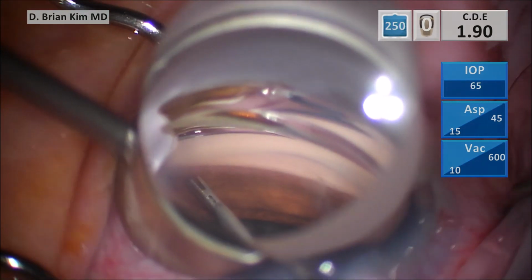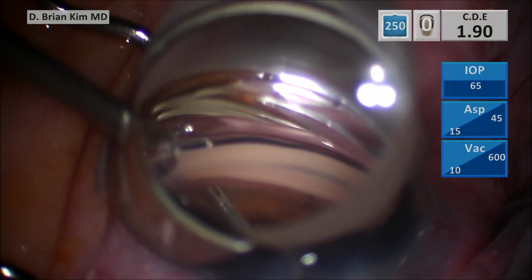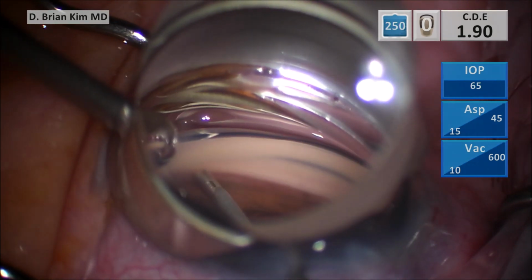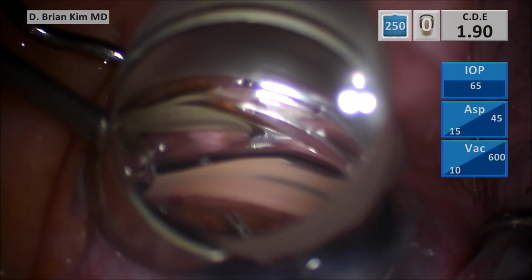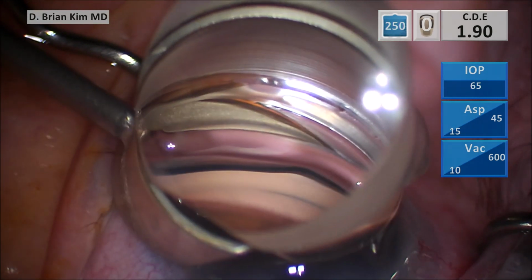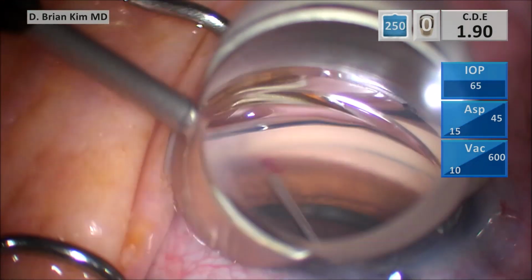I'm going to place the trocar into the TM, making sure I'm en face as well as not having the trocar being turned side to side or up and down, which can reduce the efficiency and effectiveness of the deployment of the iStent. I go ahead and push the sleeve back down, come out, and I'm pushing some more viscoelastic to ensure that the iStent is in proper position.